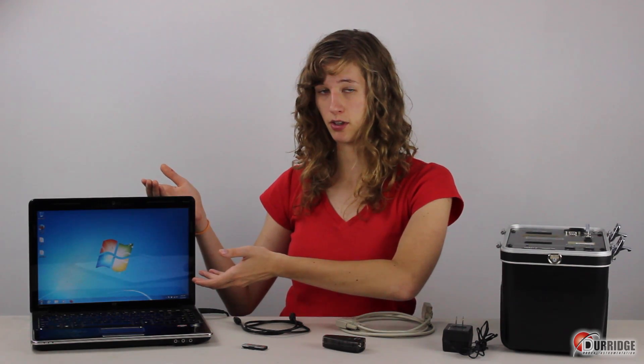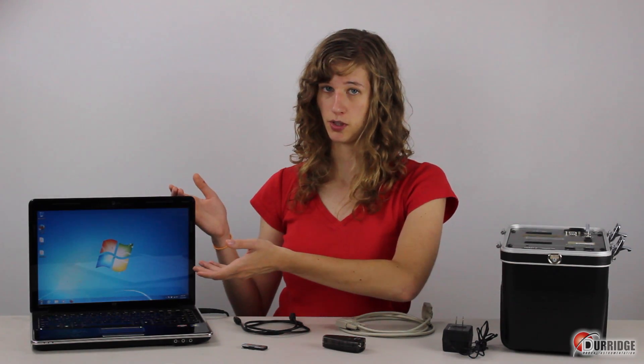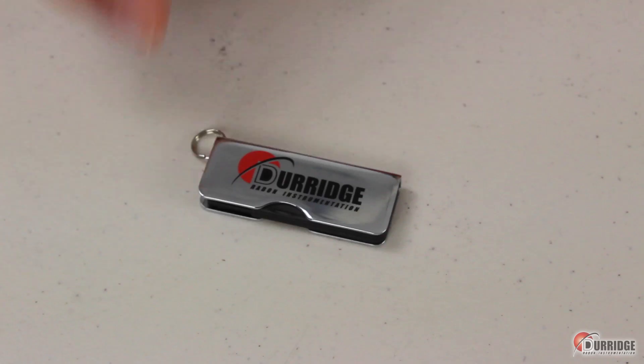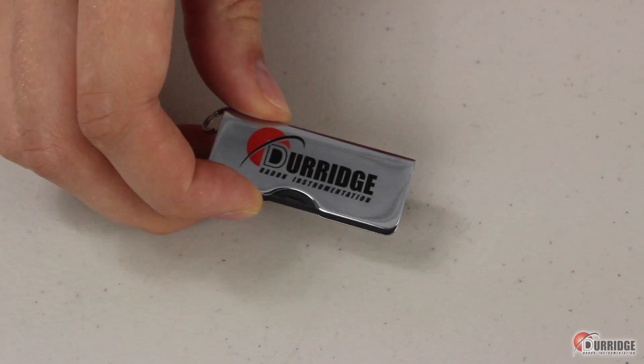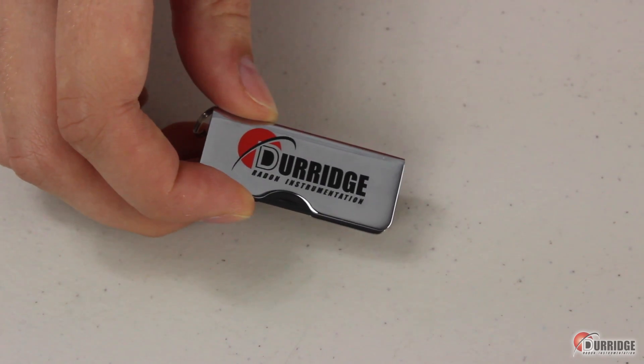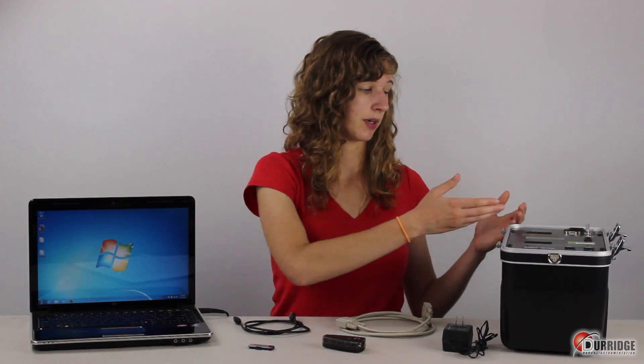Before using capture for the first time, you need to install capture software and the Keyspan device driver onto your computer. You only need to complete this install step once for the life of the computer. To complete installation, you need to have either the Durridge USB drive that was included with your RAD7 shipment, or have internet access. First, let's install the device driver so that the computer recognizes the RAD7 when it's plugged into its USB port.